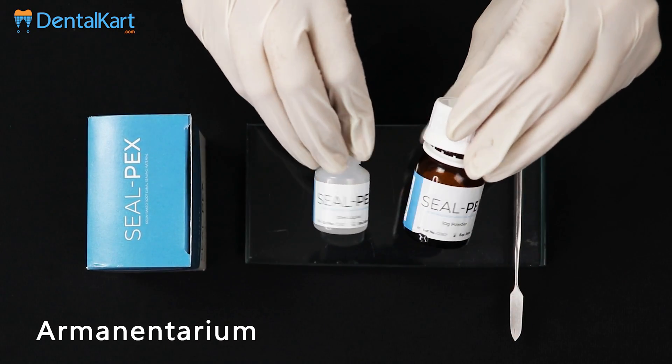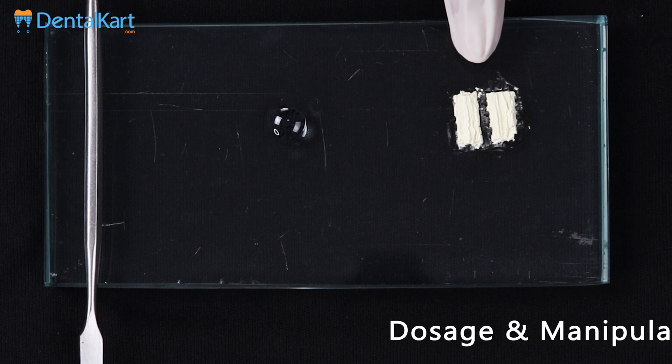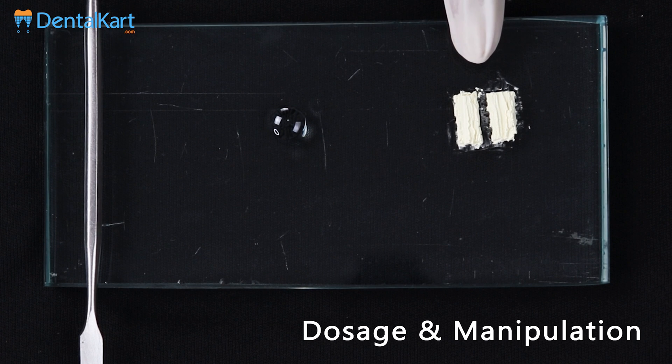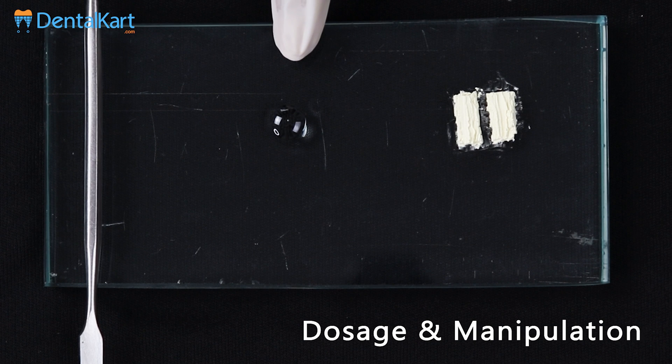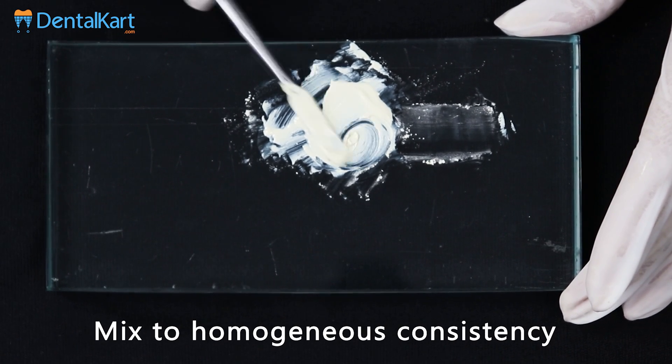Powder and liquid are mixed on a glass slab using a metal spatula. 2 to 3 unit volumes of Sealpex powder are mixed with 1 volume of Sealpex resin. Mix to a homogeneous consistency.